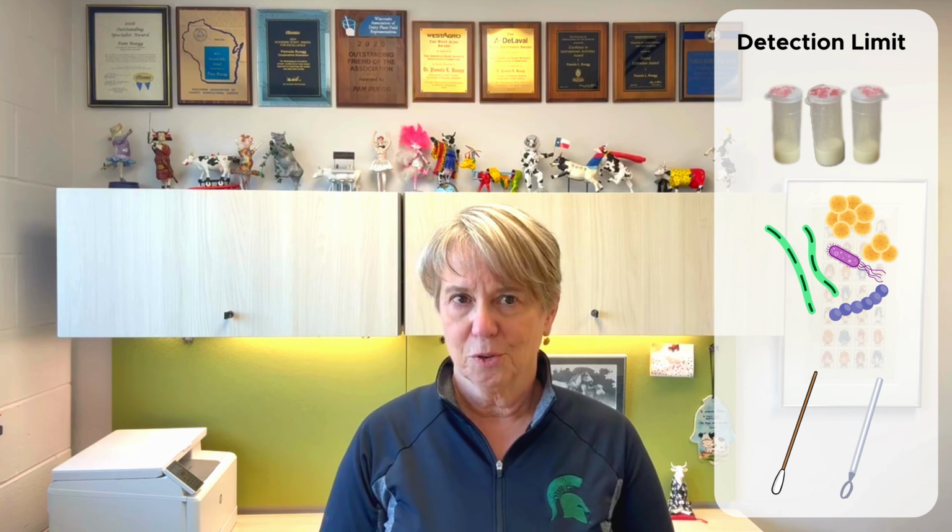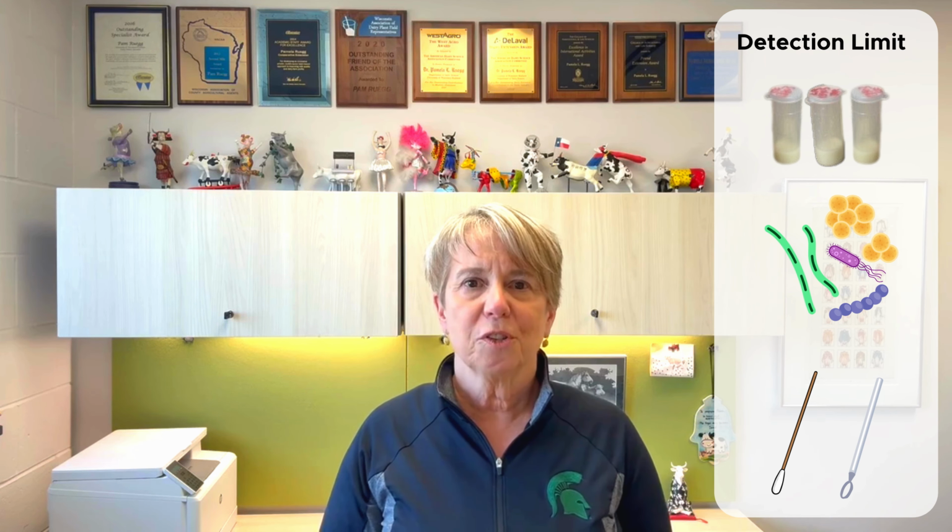In most laboratories, the use of these loops or swabs means that if we see one colony growing on that plate the next day, that means there's about 100 colony forming units of bacteria in that milk sample. So one colony on a plate is our lower detection limit, and that's about 100 colony forming units per ml. If there's less than that in that milk sample, then we typically can't detect it.